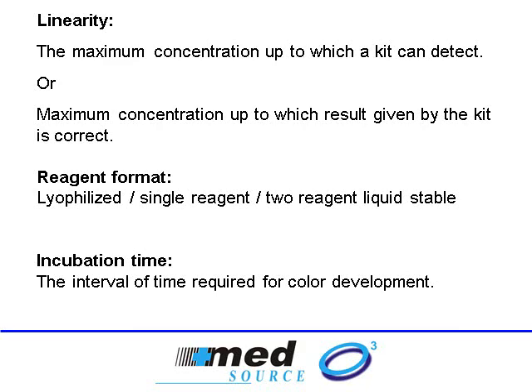On the other hand, we have reagents also available in a liquid format, either in a single reagent or in a two reagent format. A two reagent will have R1 and R2, reagent 1 and reagent 2, which have to be mixed and used within a certain amount of time. And a single reagent is probably the best because there is only one bottle with the reagent which is to be used till expiry. So obviously the best is single reagent because no preparation is required and the kit is stable till expiry. The second best is two reagent because the two reagents are stable till expiry, but once mixed they can be stable for a few weeks. And the worst and the cheapest is lyophilized, whereby the user has to manually add water to use these kits. There are associated issues with lyophilized, both in terms of expiry and in terms of accuracy.